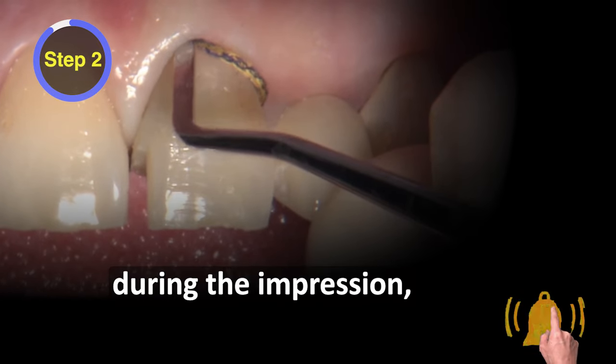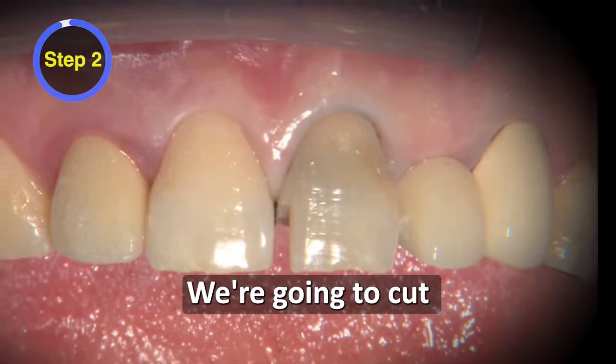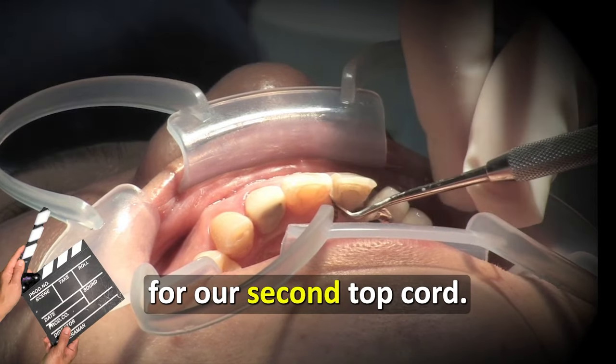This cord is gonna be in place during the impression and during the fabrication of the temporary. We're gonna cut the two ends of it on the lingual so they get packed flush — they're not gonna overlap each other. We want to leave room in the sulcus for our second top cord.